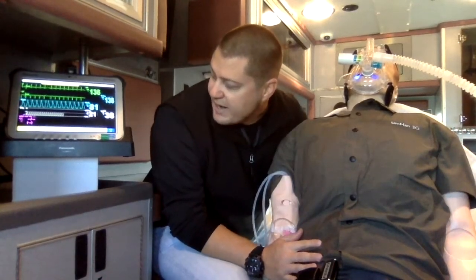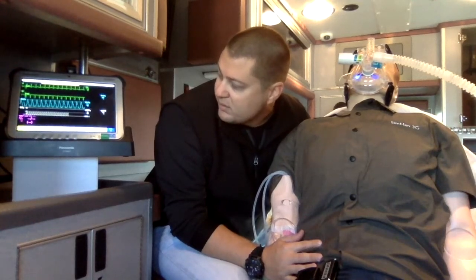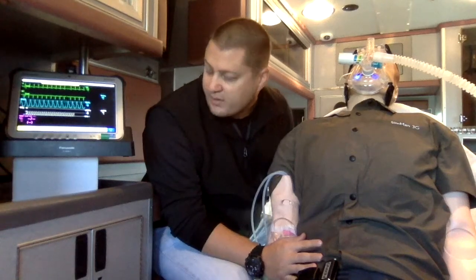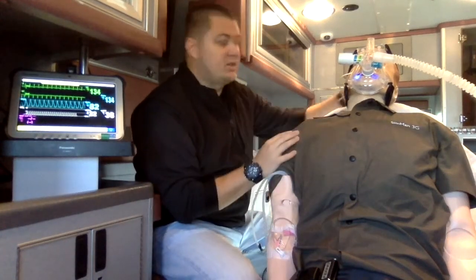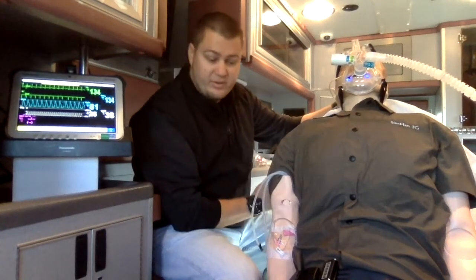Initial SpO2 is 81%. Respirations are about 40 a minute. Heart rate's in the 130s. It's normal sinus, or sinus tach on the monitor. Do a 12 lead just because you're curious. 12 lead's negative for any ST abnormalities. No acute findings are noted.